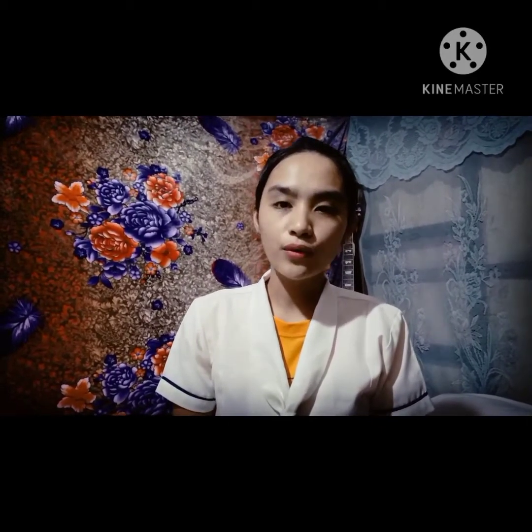Hi, my name is Mema Pasiting and today I am going to perform a return demonstration about the insertion of a Foley catheter to my patient.